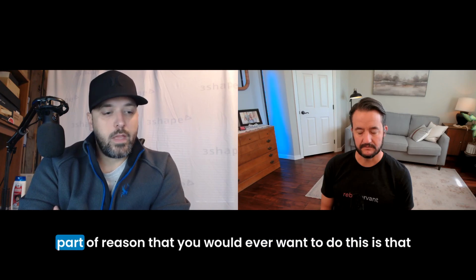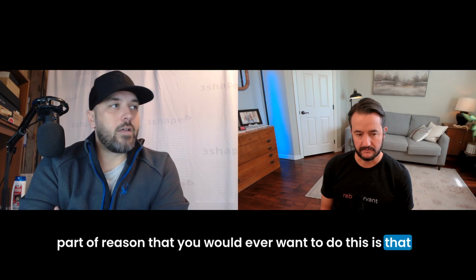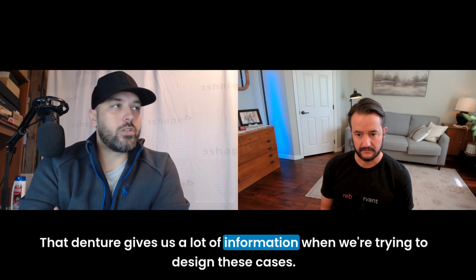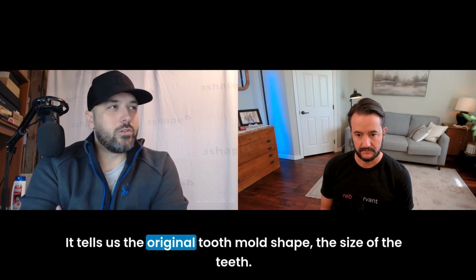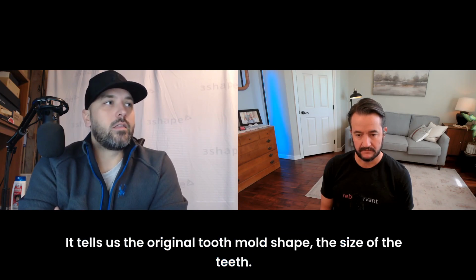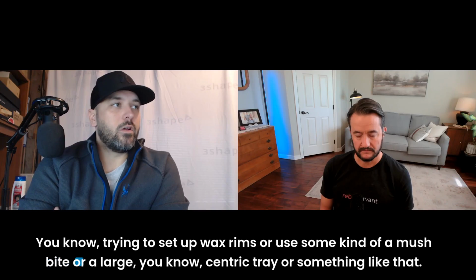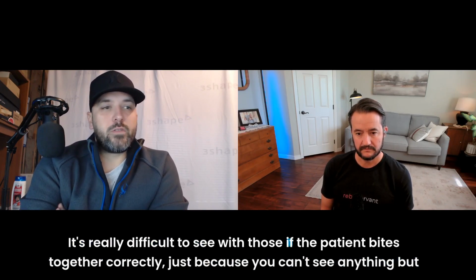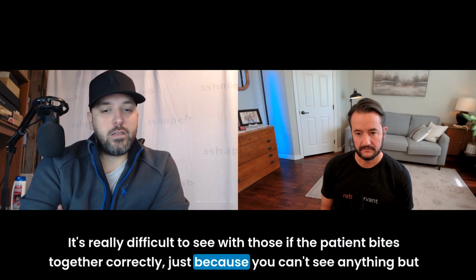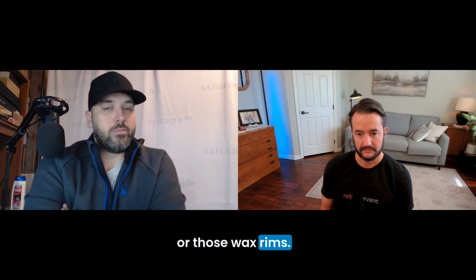Yep. So part of the reason that you would ever want to do this is that a denture gives us a lot of information when we're trying to design these cases. It tells us the original tooth mold shape, the size of the teeth. It gives us a better bite. Trying to set up wax rims or use some kind of a mush bite or a large centric tray or something like that, it's really difficult to see if the patient bites together correctly, just because you can't see anything but that bite tray or those wax rims.